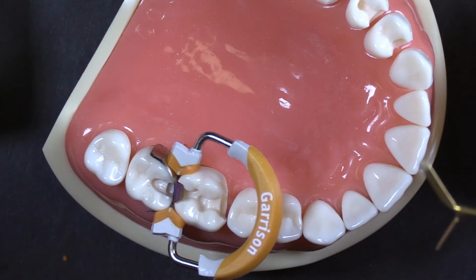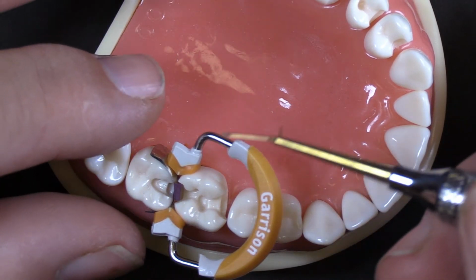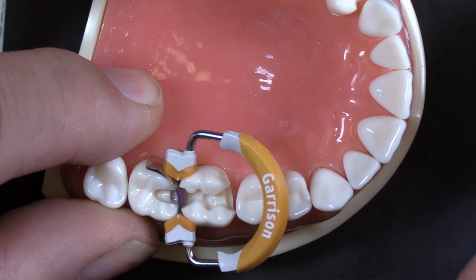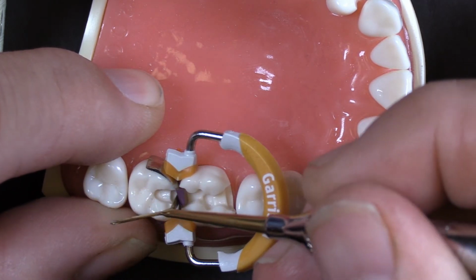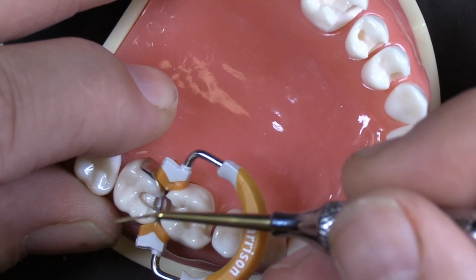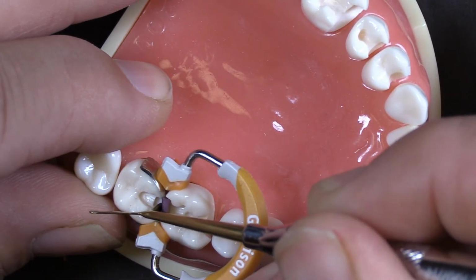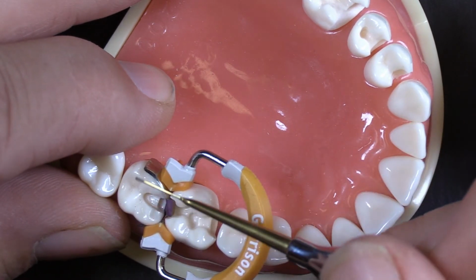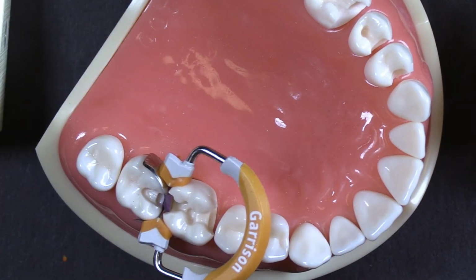You're removing the nice curvature that the band has already built in, and then you're pulling it away from the buccal and the lingual margins and potentially creating the gingival overhang as well. So what you want is just a tugging motion, not an aggressive burnish, just so that you know that that band is in firm contact with the adjacent tooth.